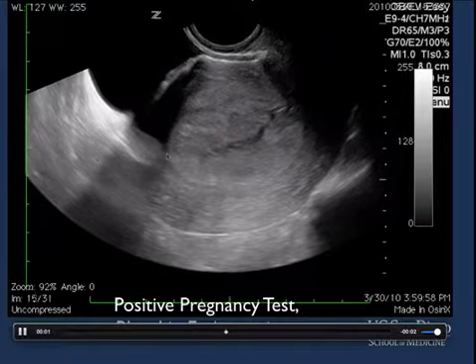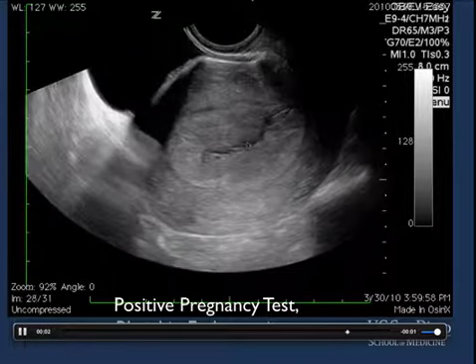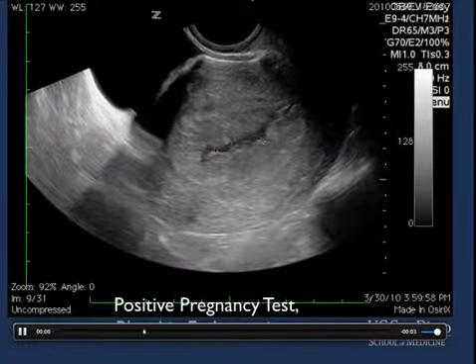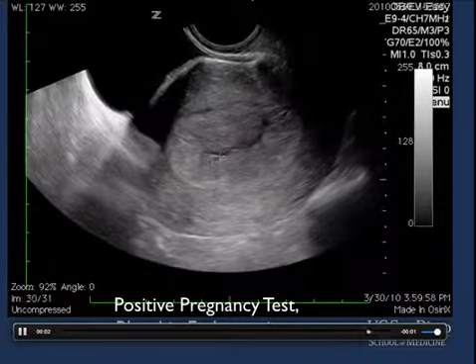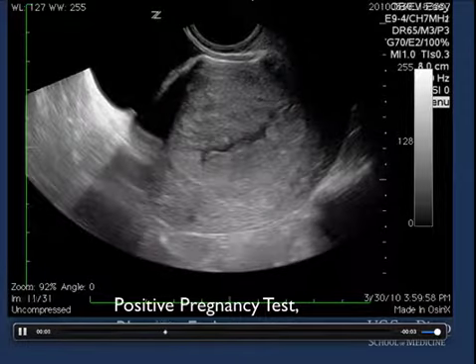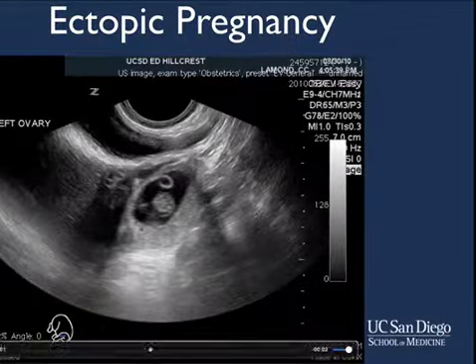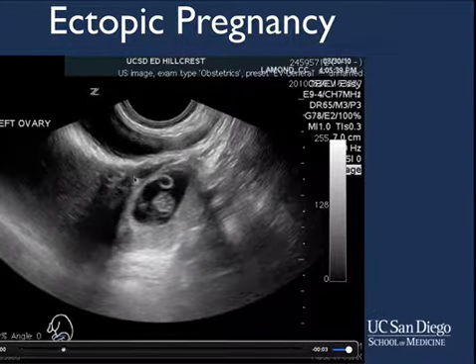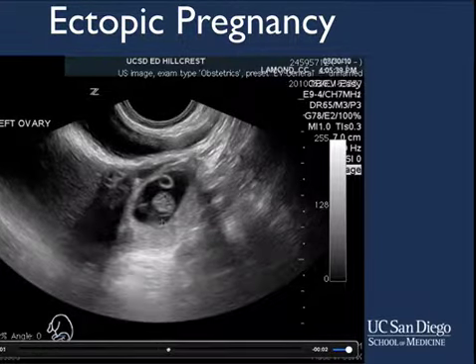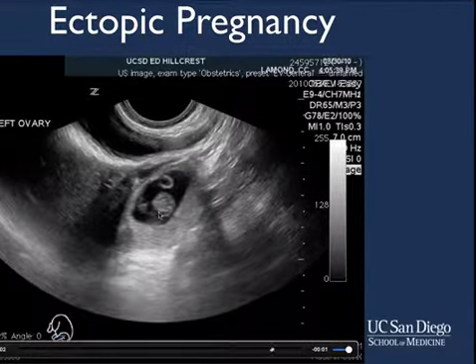Finally, this is another use of pelvic ultrasound. When we see a uterus with no clear dancing baby within it and a little bit of hypoechoic area, which usually represents blood, we become concerned for an ectopic pregnancy. Then we look towards the area of the ovaries, and sometimes we can see a tubal ring with an ectopic pregnancy with actually a heartbeat seen right here.